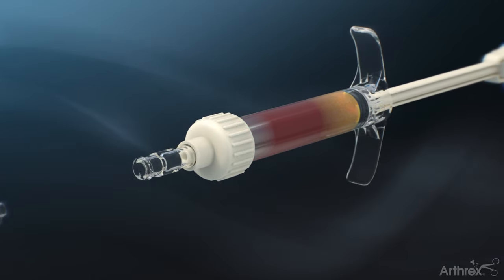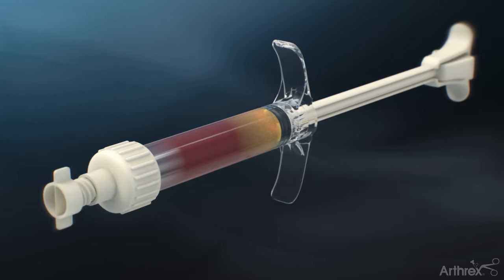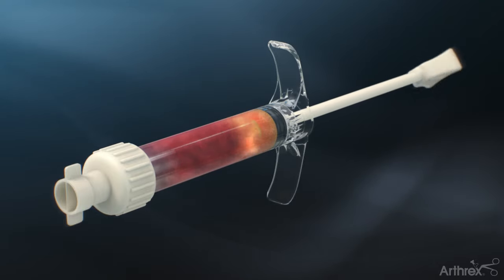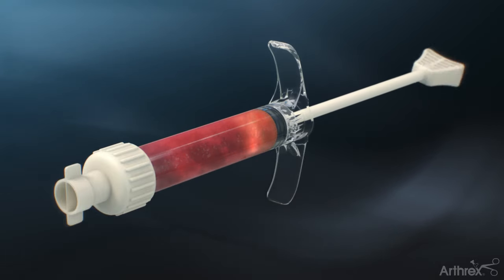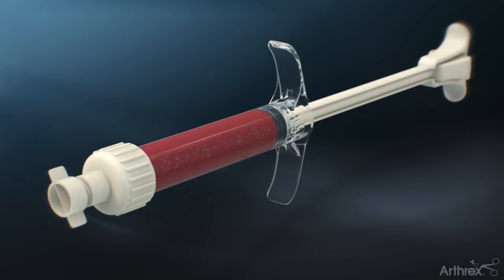The female-to-female luer adapter is removed and the luer cap is secured to the mixing syringe. Unsnap the push rod from the mixing element. Push and pull the mixing element back and forth until thoroughly mixed. Pull back on the mixing element and snap the push rod back onto the mixing element.